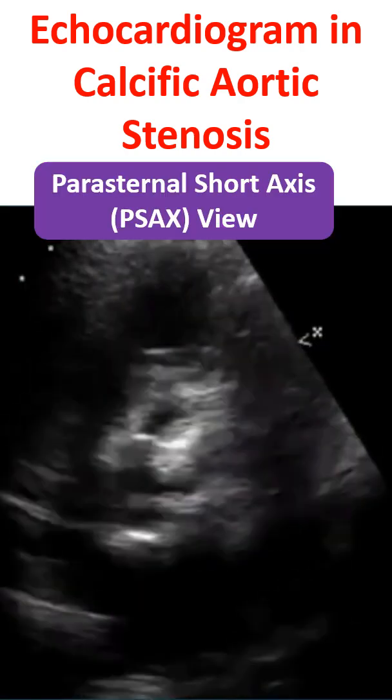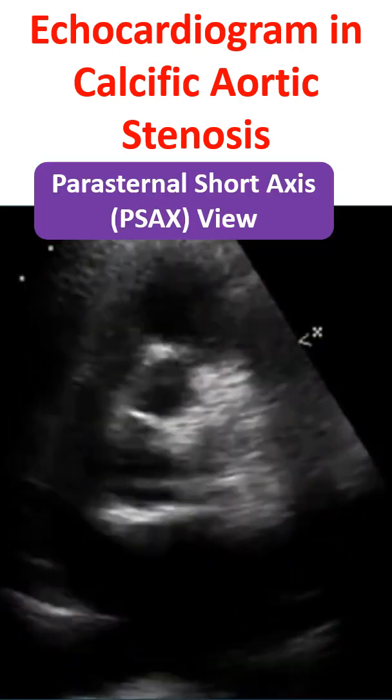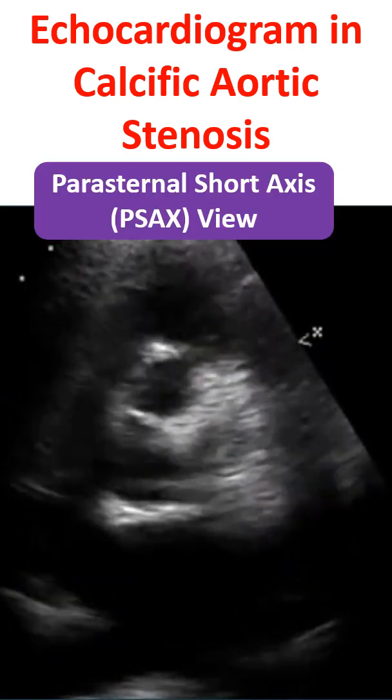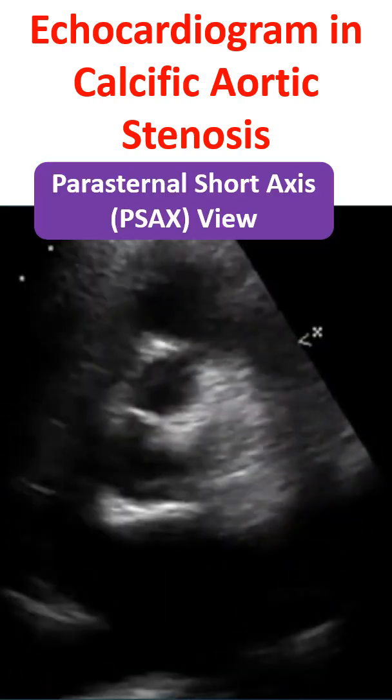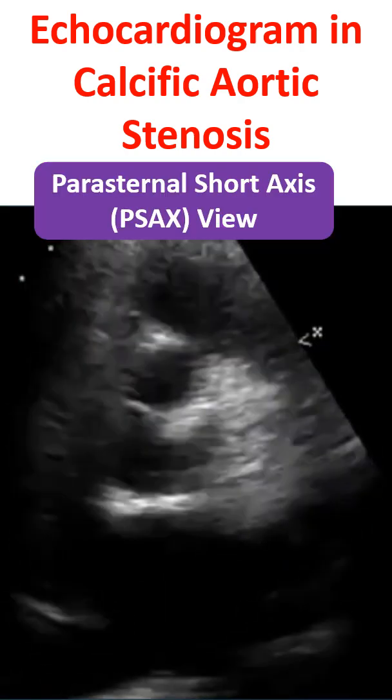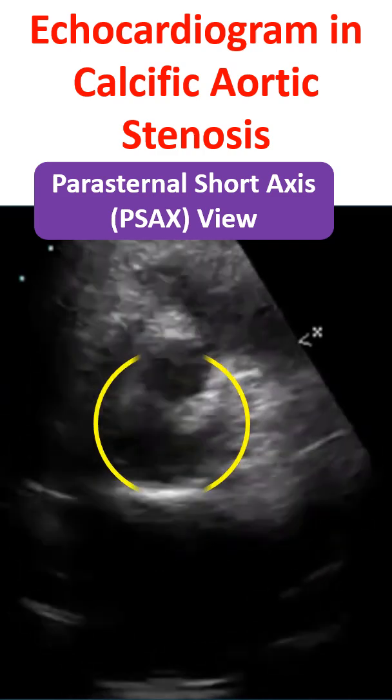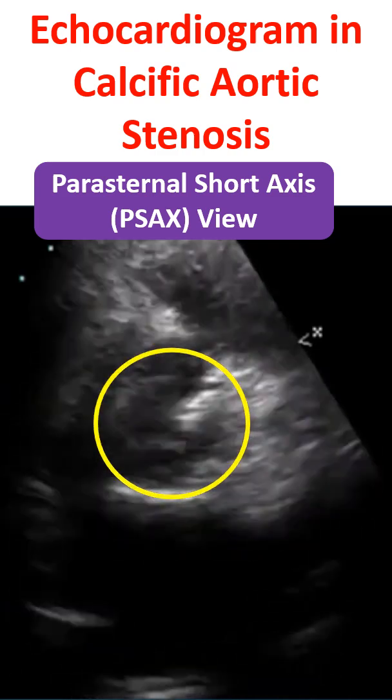Calcific aortic stenosis in parasternal short axis view showing three leaflets. Dense calcification is visible.